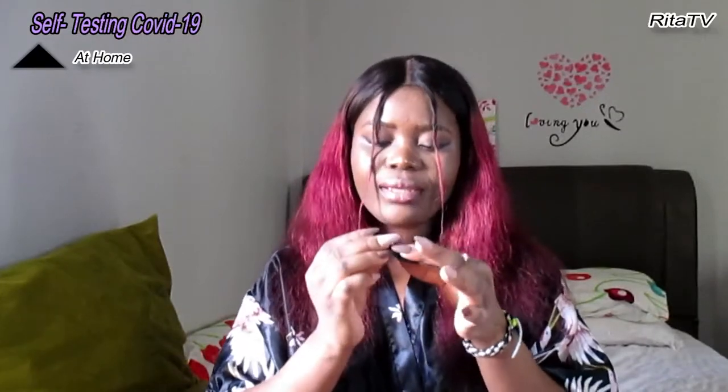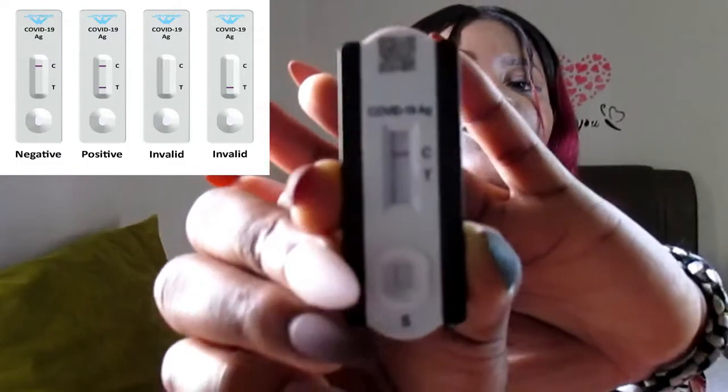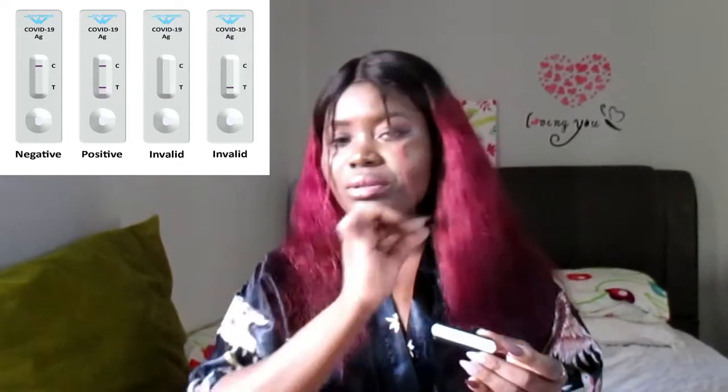Yeah, this is it. It shows 1 line, so that means I am COVID-19 negative. I don't have the virus. So you guys can also try this. You can get this online. I bought mine from Lazada, so you can also get yours online and just try it out and see.